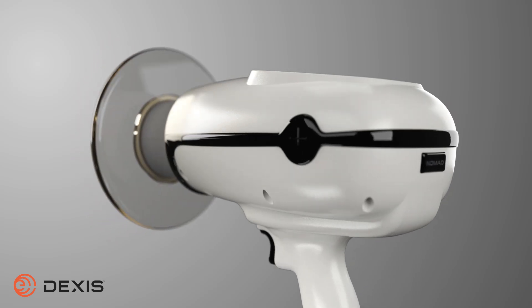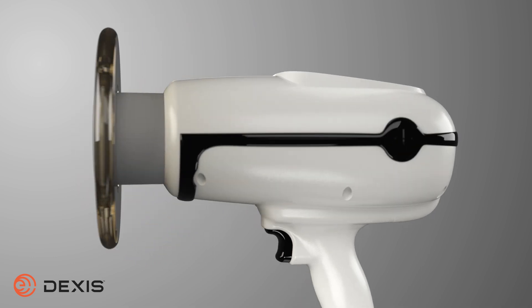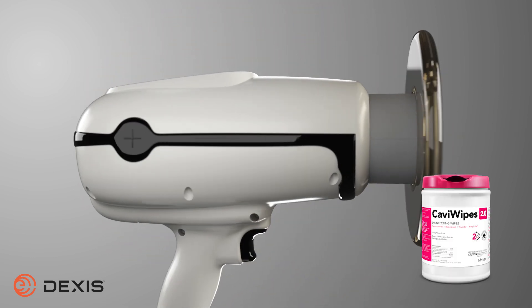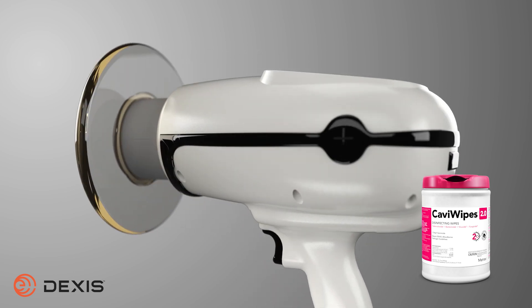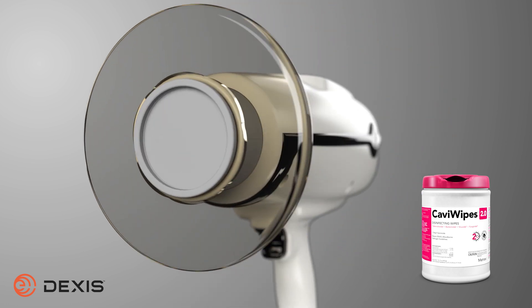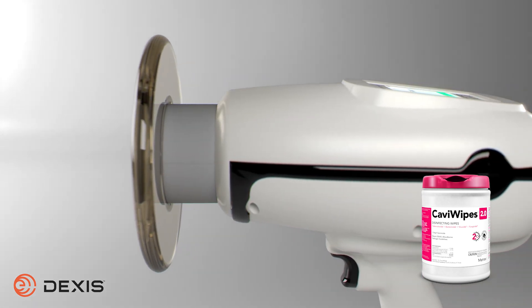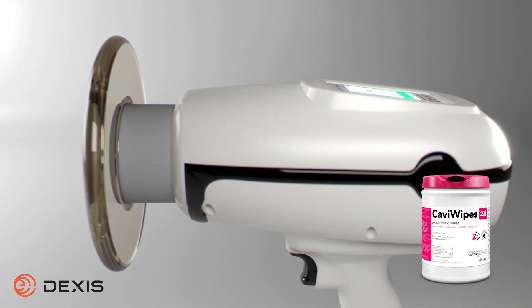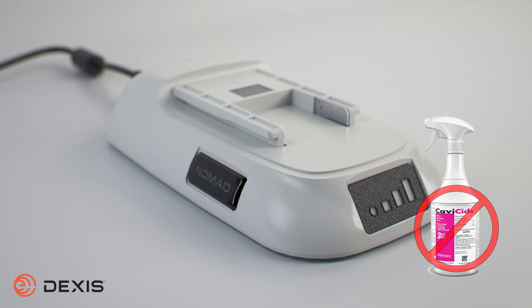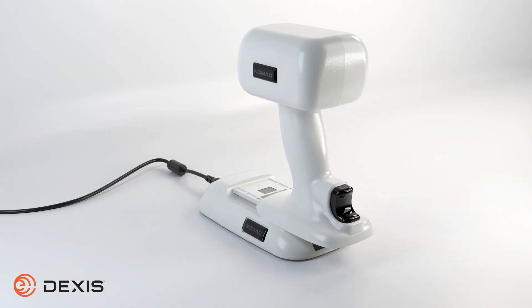It is recommended to disinfect the exterior surface of the Nomad and handset between each patient. The recommended disinfectant wipes for the Nomad are Caviwipes. Do not use cleaners intended for use on hard surfaces, as certain chemical combinations may deteriorate the Nomad plastic. You may also spray Cavicide solution onto a towel to wipe down the Nomad. Make certain the towel is not oversaturated to ensure that moisture does not seep into the Nomad, potentially damaging the electronics. Do not spray disinfectant or cleaners directly on the Nomad battery, handsets, charging cradle, or AC power supply.